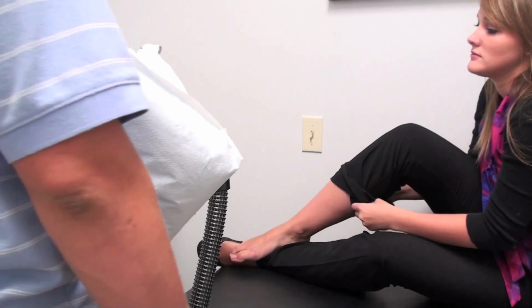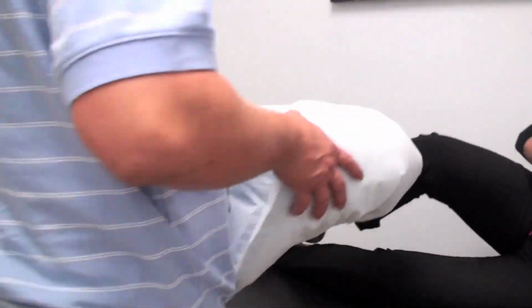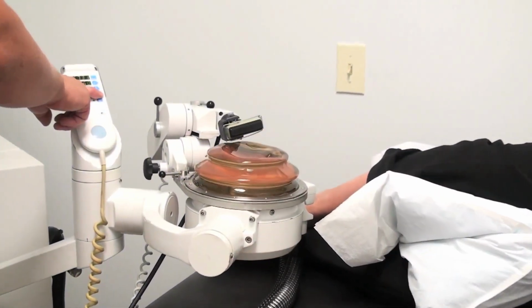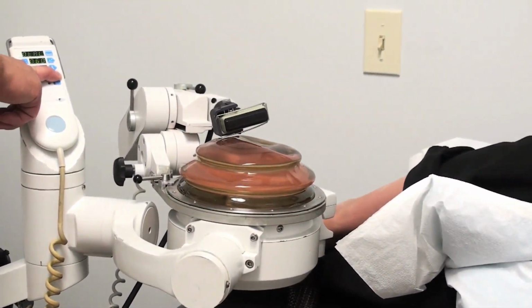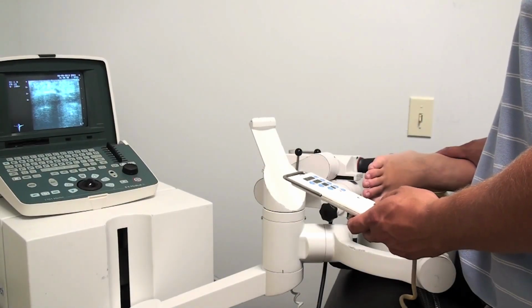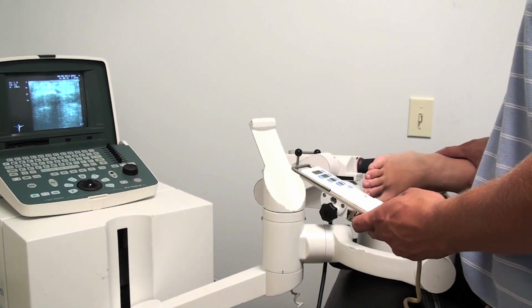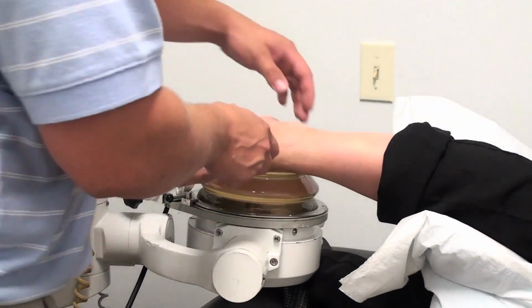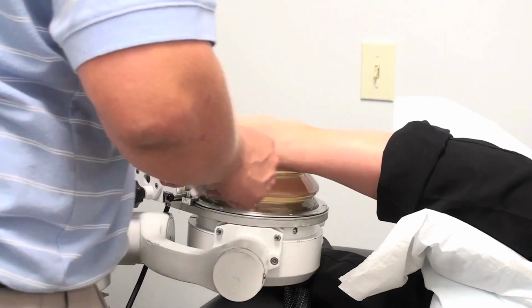Can you explain what shockwave therapy is? With the shockwave procedure, we're going to try and make you as comfortable as possible. It's going to take some time after we've numbed you up to allow that Novocaine to set in. The procedure itself has its own analgesic property to it, but first we're going to lay you down. We're going to place your foot on the bubble, get some ultrasound images, kind of like a baby picture. We're going to be able to see right within your foot there. And once we get those images, we get it put right where we want.